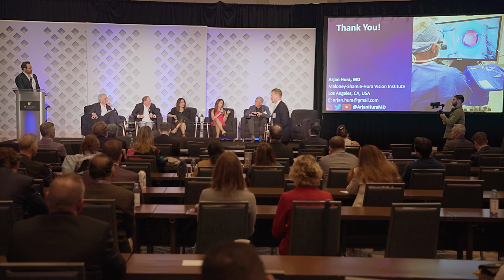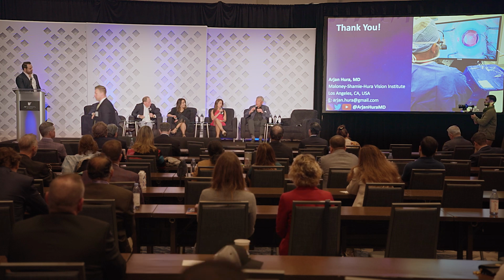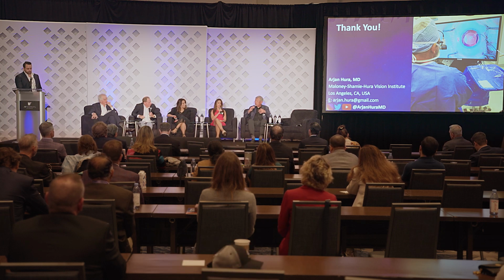And since this is an Ally user meeting, I will bring it back to this. I love using Ally for so many reasons, but RK patients are one where, just because you can get skip lesions and it's one more source of variability, I don't actually laser RK patients. I'm curious if people on the panel are doing Ally for cap, your cap frag? Yeah. So for a long time, I didn't use femtosecond laser on RK patients in general, until someone I know started doing it.